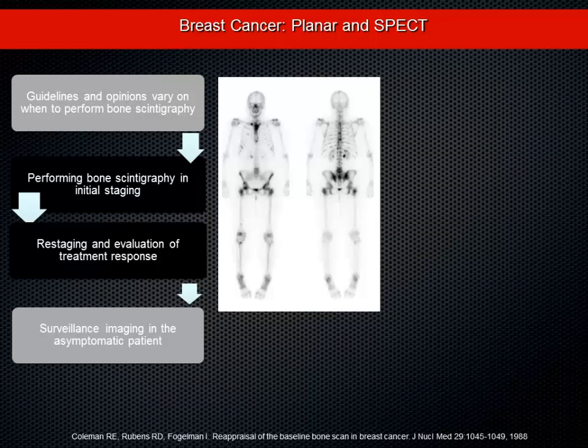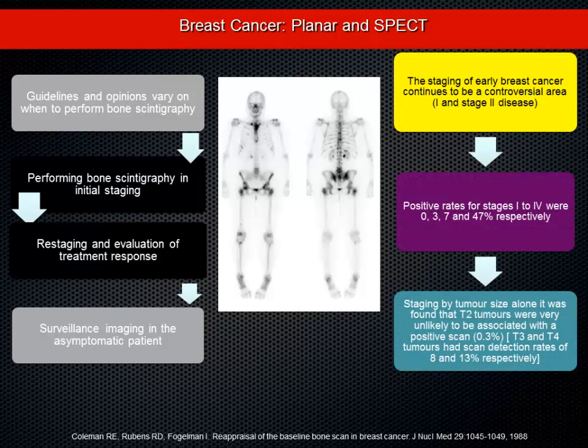And the guidelines vary because what all we practice in terms of bone imaging and other modalities, most of the investigation and papers are from the 80s and 90s, but the technology has moved, the treatment has moved, and still there are no definitive algorithms. Still it is challenging, and in practice varies. There is no one method where you can strictly say this has to be done. And at the end of the day, if your oncologist asks for a bone scan, you will do it irrespective of what the guideline says. So whether to perform bone scan in initial staging or in restaging or just in surveillance.